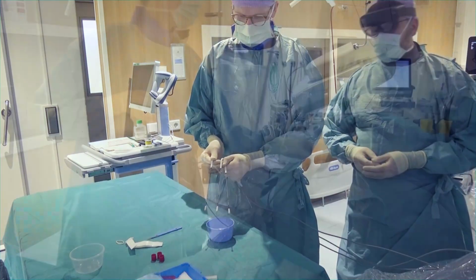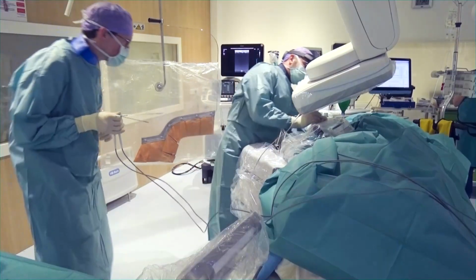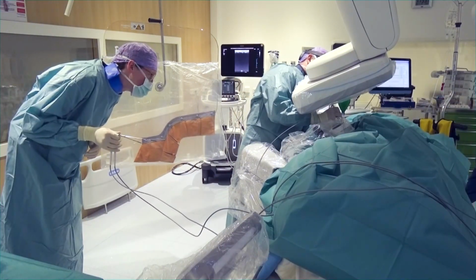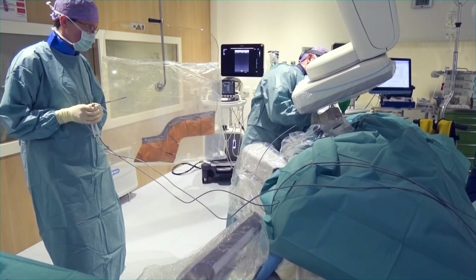Then it's time to start the introduction of the first needle. The needle is inserted through the effector of the robot, and then a simple joystick control is used to bring the needle to its desired position.